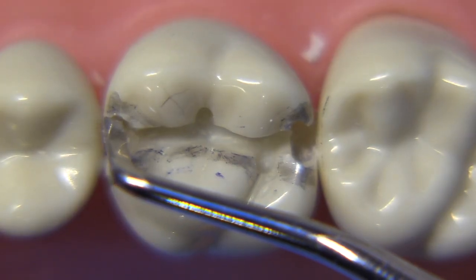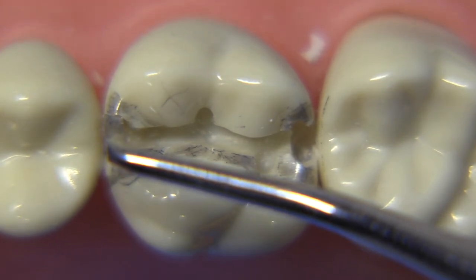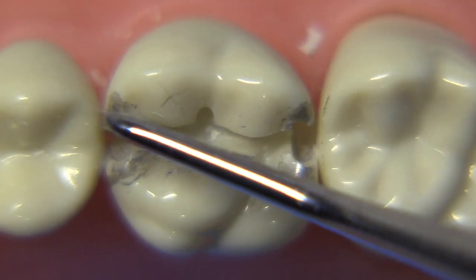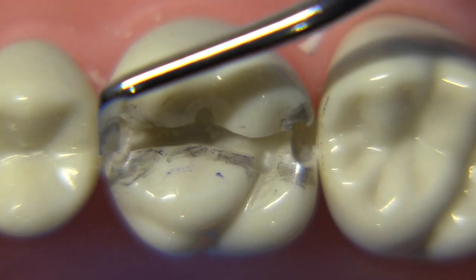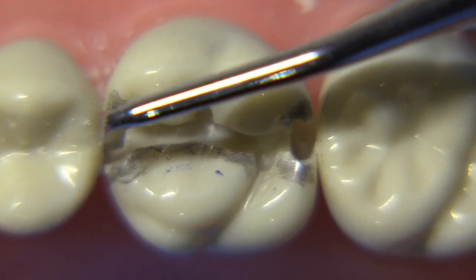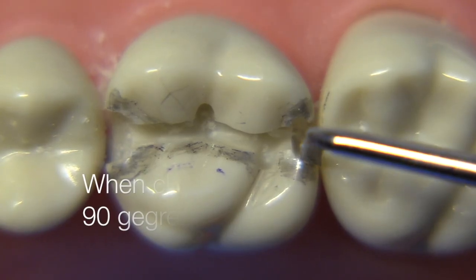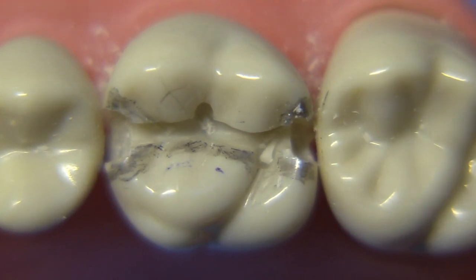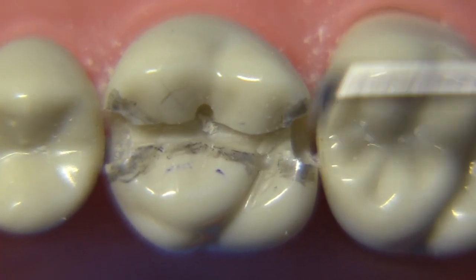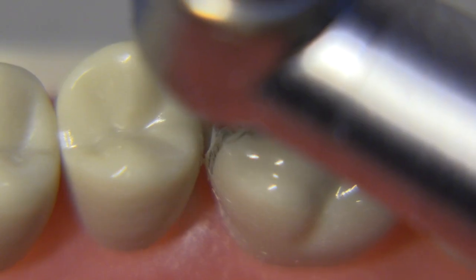I like using the 10-614 enamel hatchet — this is the original G.V. Black instrument. We can just teeter-totter that mesial-distally and chip that little area away. This is a great way to avoid hitting the adjacent tooth and to confirm you haven't gone too far gingivally. Now we're going to remove those little C-shaped bird beaks on the facial-lingual of both mesial and distal boxes. If you cannot get the instrument in easily, you need to deepen the axial wall — go more axially — and widen the gingival before placing the instrument, to avoid scraping the adjacent tooth. Keep the hatchet so the flat end is towards the wall you're cutting and the bevel is away from you at all times.